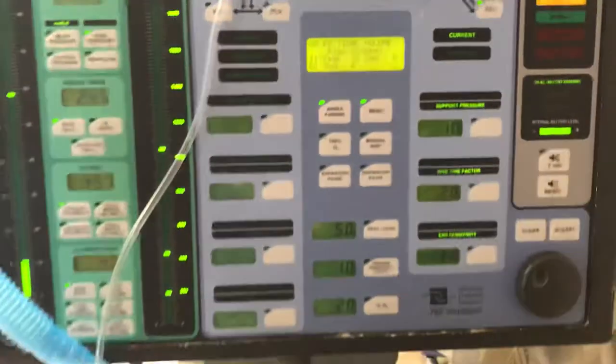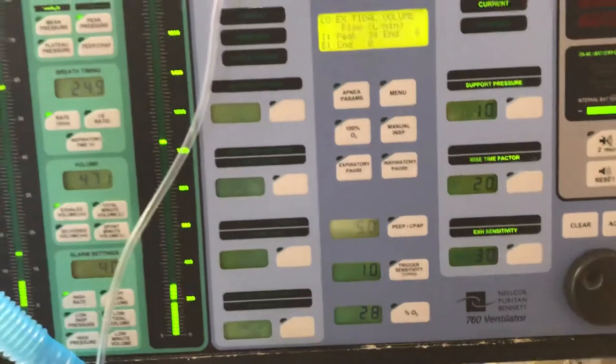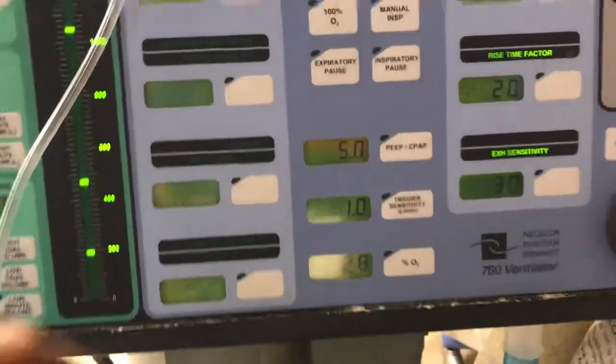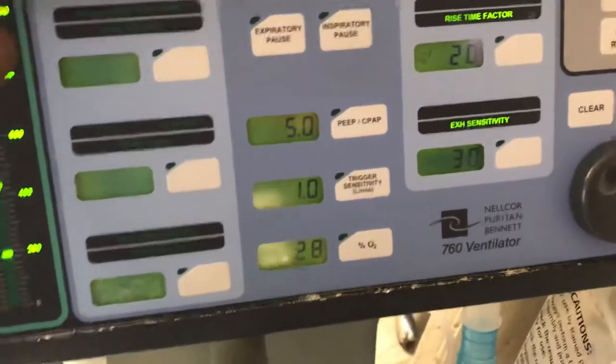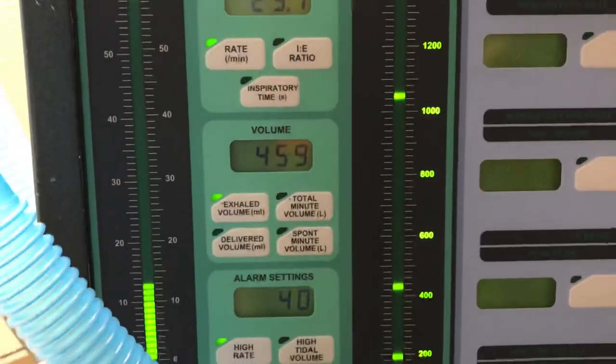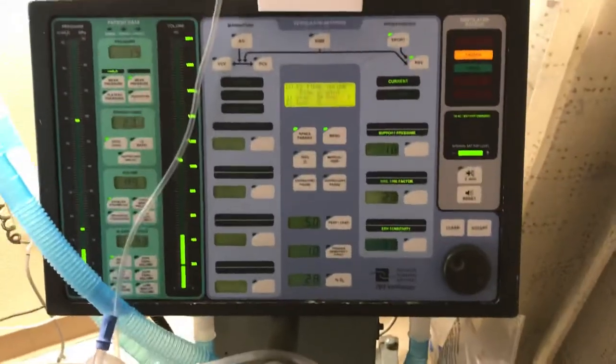A sensitivity of 3 makes it a little more difficult to trigger the breath. Going down to 2 makes the inspiratory sensitivity a little easier, and 1 is the easiest to trigger. We're also trying to get our volumes — breathing 10 to 24 times a minute — and checking volume settings in minute volume.